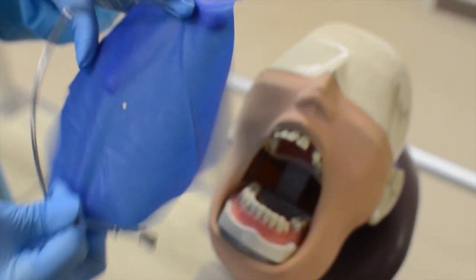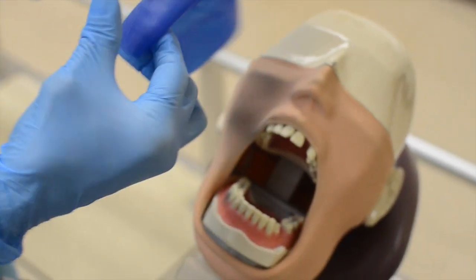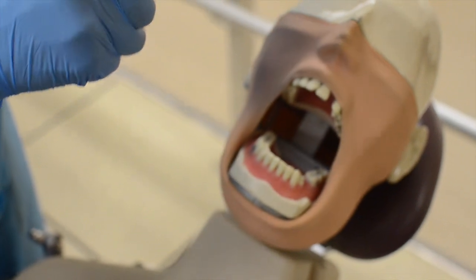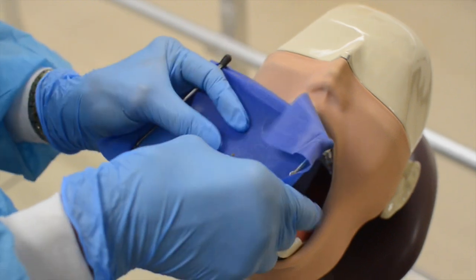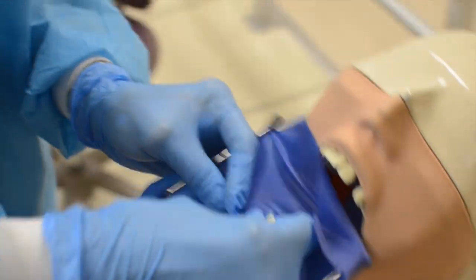There's one other clamp I want to demonstrate. This is one that you will use quite a bit in endo. And for some class fives, you may use it. Let's apply this. For this tooth, that little anterior clamp that we talked about, you have to put the rubber dam on first.